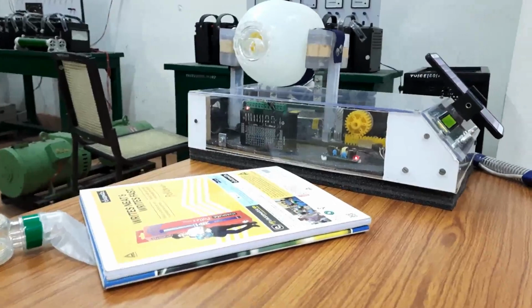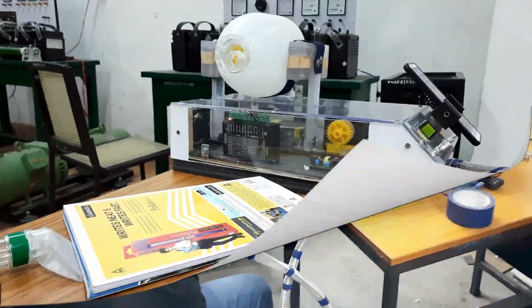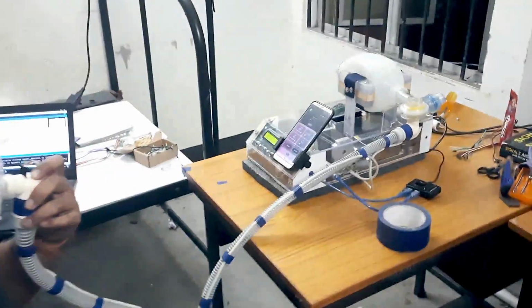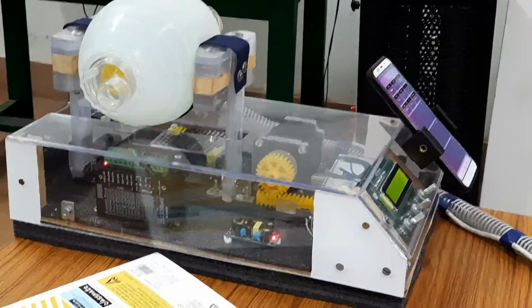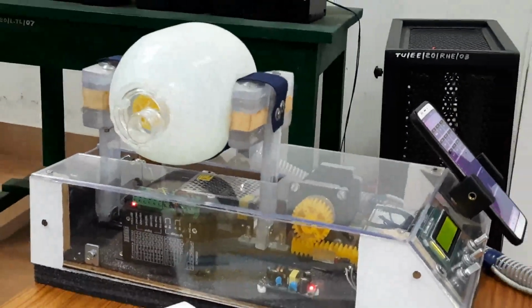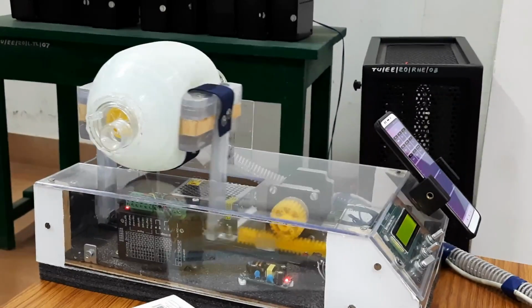The hardware can be categorized into three sections. Number one is the breathing circuit, second the mechanical system, and third the controls. The breathing circuit consists of the Ambu bag, the single limb breathing circuit and the mask. The Ambu bag is the heart of the ventilator, which is a manual resuscitator generally squeezed by medical staff to push air into the lungs.